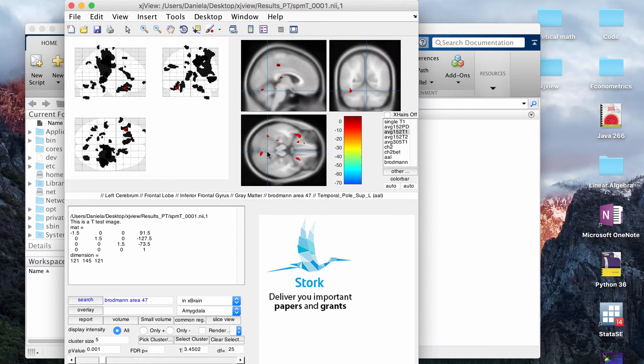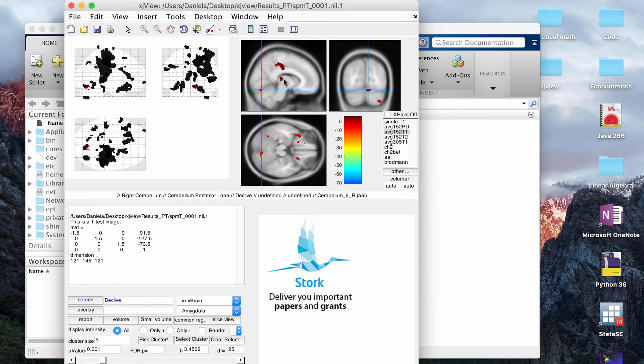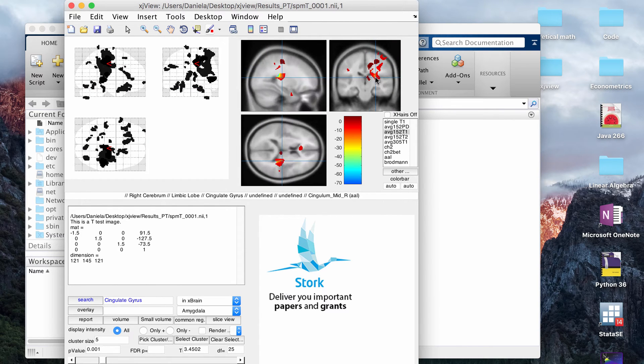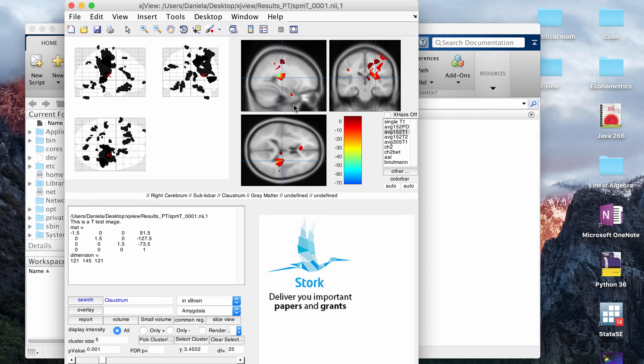If you click around, it will again automatically be updated and tell you where you are in the brain, so that's useful. For VBM, a lot of the time you want to know about the clusters.